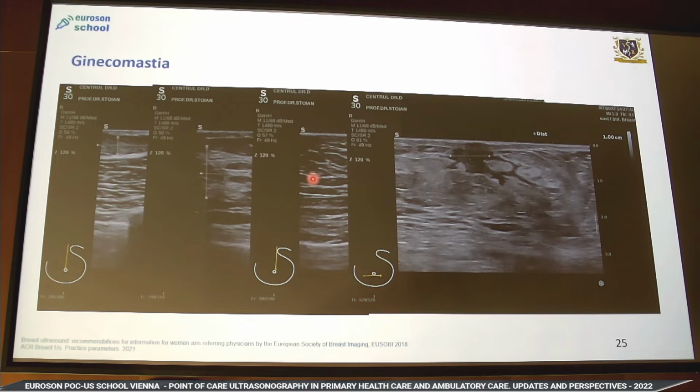And of course, this is also a male. Even if it looks like a female, with all the layers, skin, subcutaneous fatty tissue, here is really an epithelial structure. Moreover, I see epithelial proliferation that goes along inside the duct. So this is a florid gynecomastia. I re-emphasize this one to go to an endocrinologist and have a complete checkup.